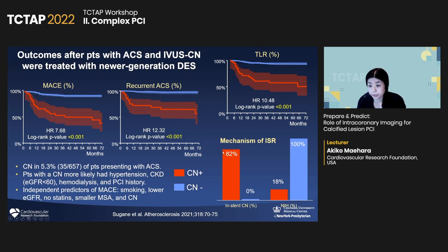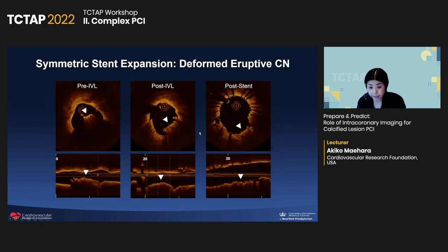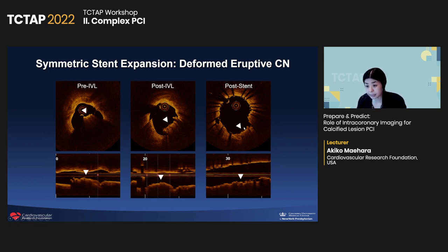Data from Japan shows calcified nodule and their poor outcome. They show late IVUS at the time of the event, and about 80% in the region having the calcified nodule — the mechanism is reproducing the calcium in the stent. We have to find a good method to make it better. A potential way could be lithotripsy. Even though we don't know the long-term outcome well yet, it looks like the calcified nodule by angio looks good after lithotripsy and stenting. In a different case treated by lithotripsy, you see the calcified nodule, and after lithotripsy it looks like the calcified nodule is almost resolved in the region. After stenting, you see good stent expansion.